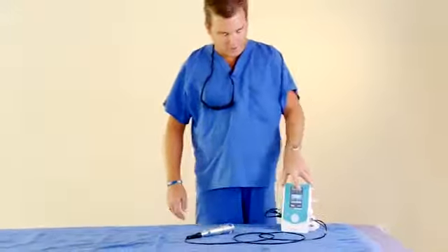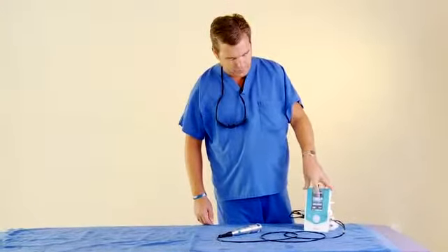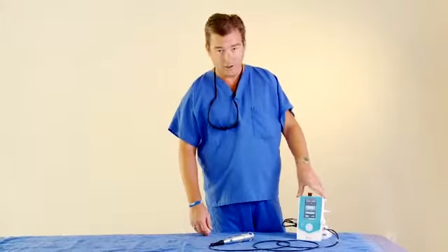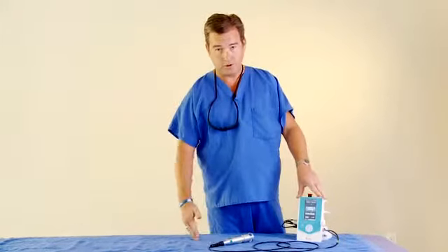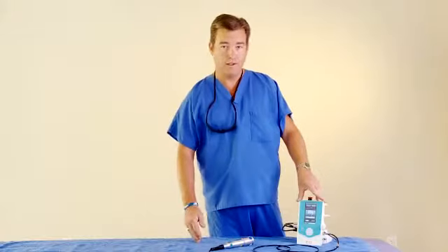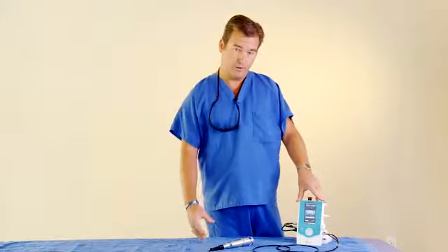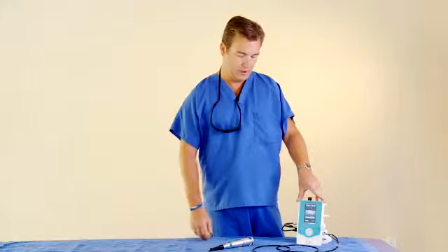If you feel that the patient didn't receive enough of the laser treatment, you can go back and recycle and do that same protocol again. You can do a partial protocol, so you can do phase 1 and 2 only, then stop the laser, or you can turn the wattage down to achieve the amount of joules per centimeter squared that you need for that patient.